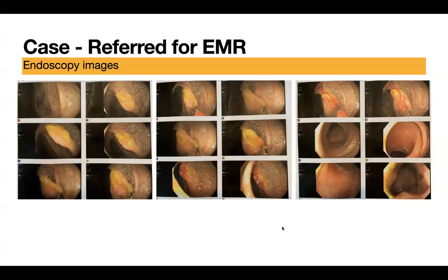Nobody will argue with that when you say I have reached the cecum and entered the TI. But otherwise, you want to take pictures of the appendix orifice, the cecal base, the ileocecal valve and the terminal ileum.